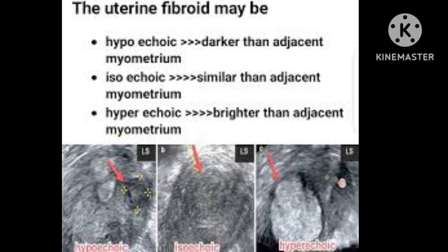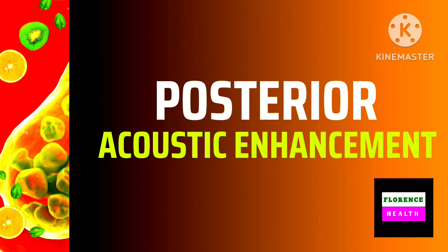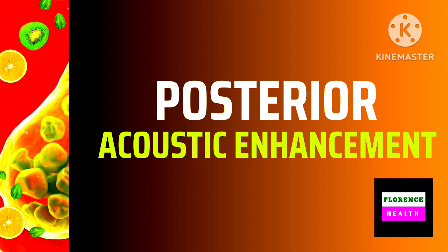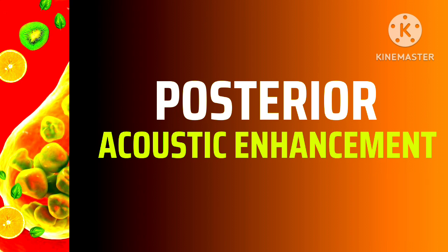The left side figure shows the fibroid is hypoechoic compared to the surrounding uterine myometrium. The middle figure shows the fibroid is isoechoic compared to the surrounding myometrium. And the right side figure shows the fibroid is hyperechoic compared to the surrounding myometrium. Now discuss about posterior enhancement or posterior acoustic enhancement. What is the main funda behind it? Let us discuss.